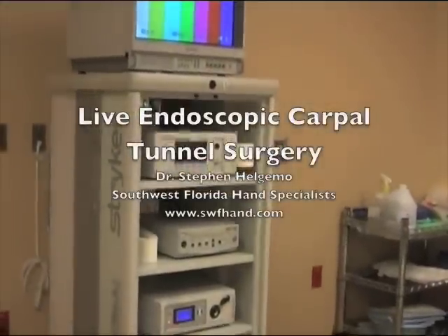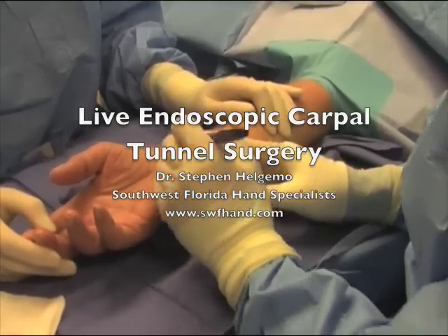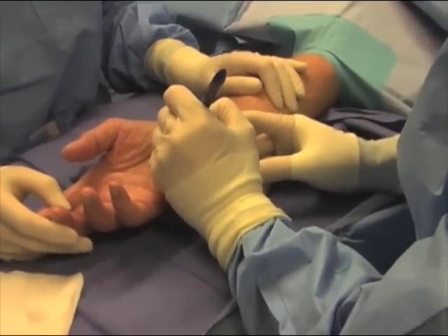What follows is graphic medical footage. This is live endoscopic carpal tunnel surgery performed by Dr. Stephen Helgemo with Southwest Florida Hand Specialist.